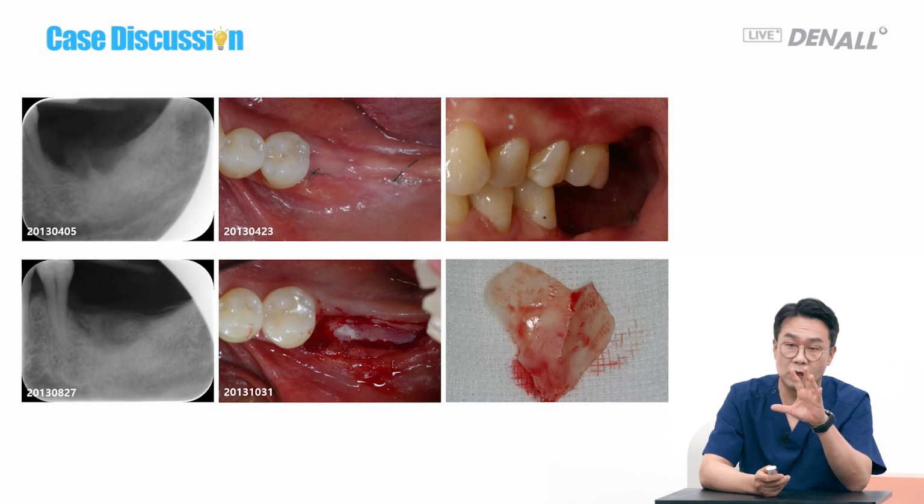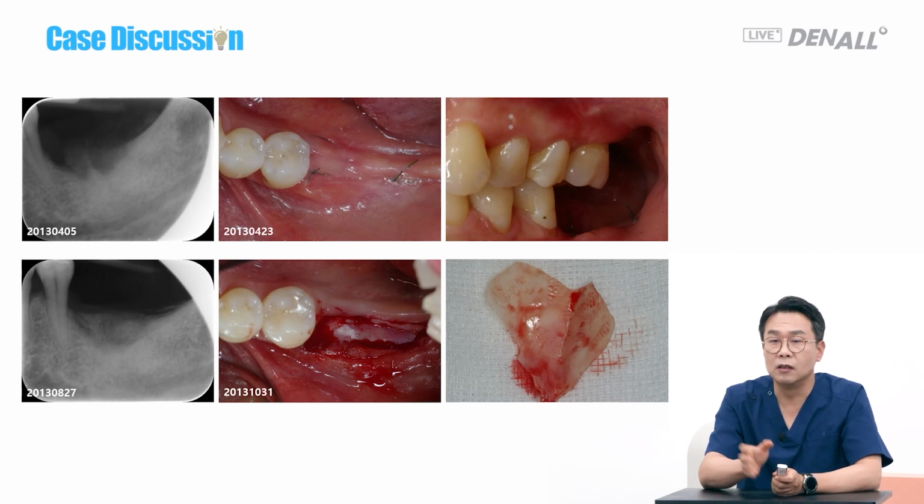Keratinized tissue zone is not sufficient, so when I removed the membrane, I did the FGG. You can see the DPTFE membrane there, which is not available anymore. We don't have a stiffer membrane available these days. It should be stiffer than that to keep the form. So it is hard to use a resorbable membrane, but the stiffer form retaining one would be better.